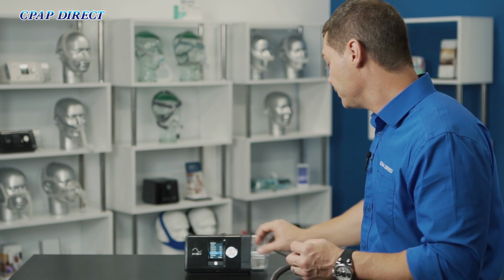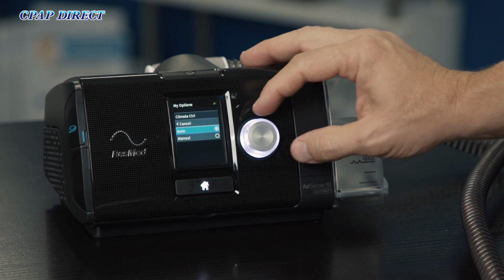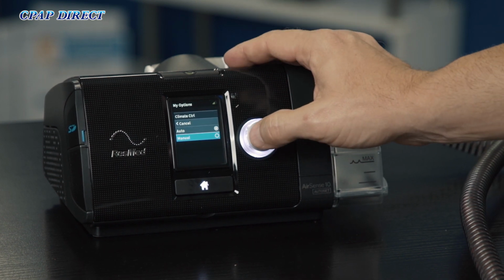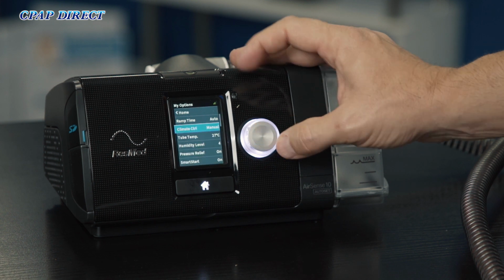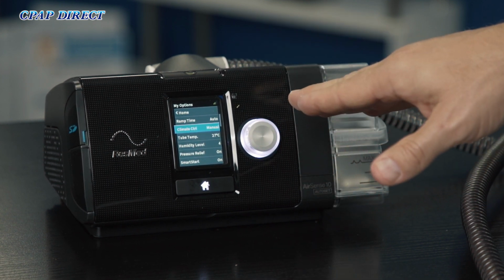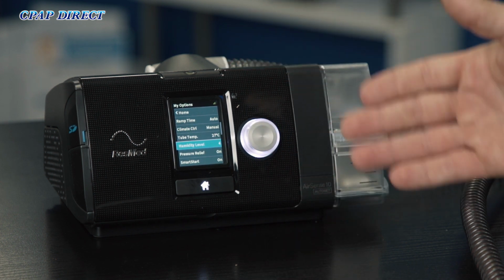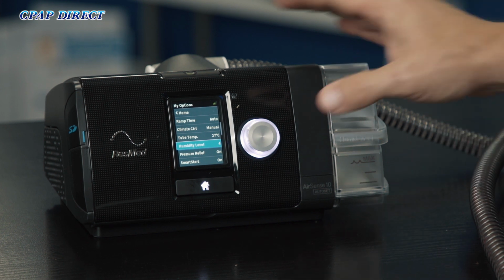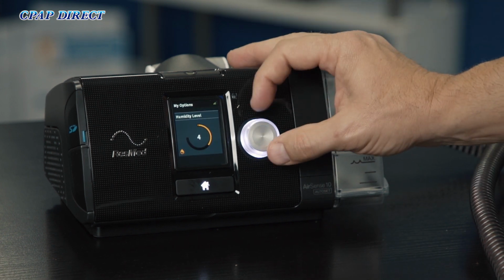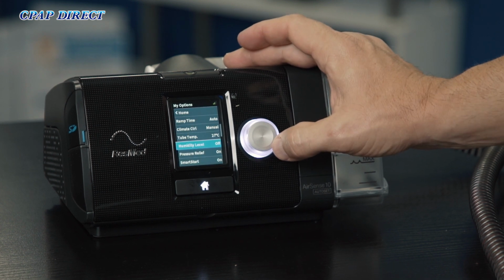The way you do that is you scroll up to climate control and press the button. Scroll down to change it to manual, press the button. And then you'll see you have tube temperature separately to humidity level. Scroll down to humidity level, which is the wet heat. This is how hot the heater plate gets in the humidifier. Press on that button and wind it back to off, and then press that button to lock that in.